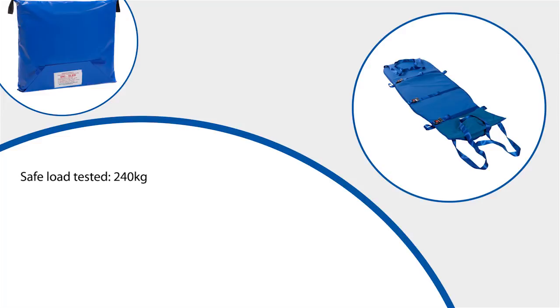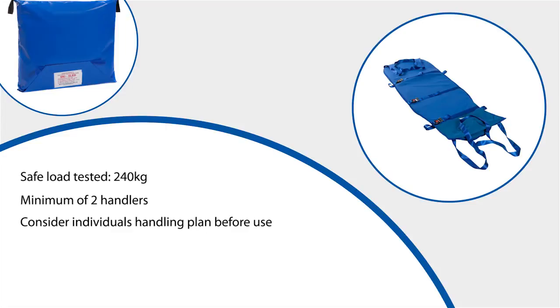It is advised that a minimum of two people handle the ski sled, and as a general rule the maximum weight being pulled should not be more than the combined weight of the handlers. Each patient should have their own handling plan, and this should be considered before transferring any patient using this equipment.